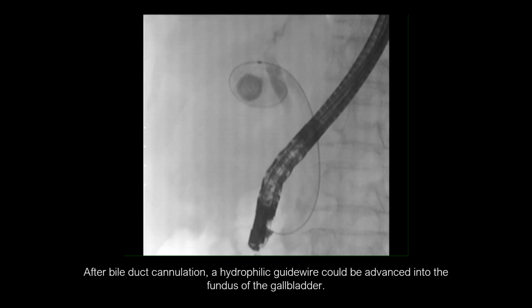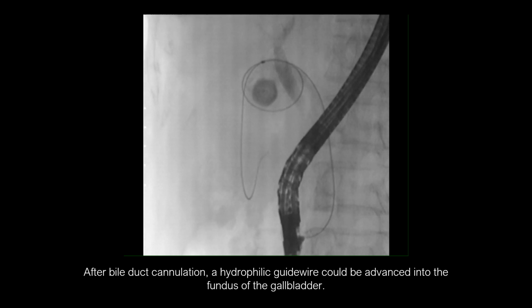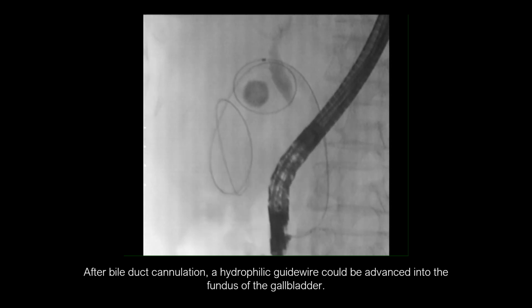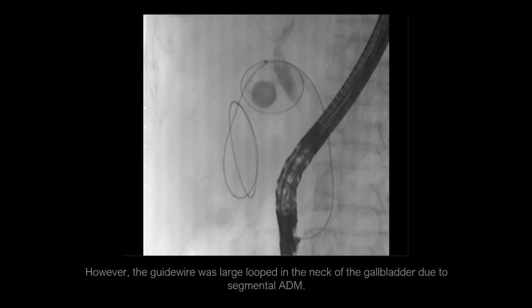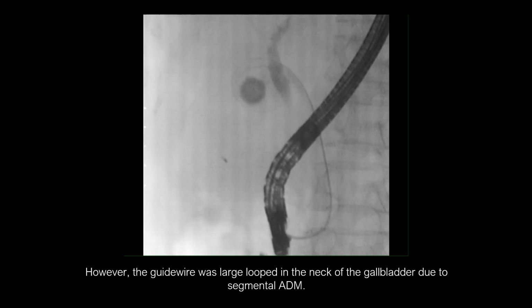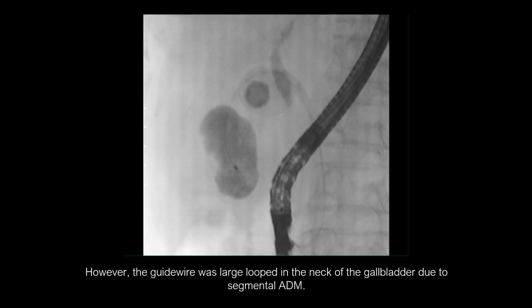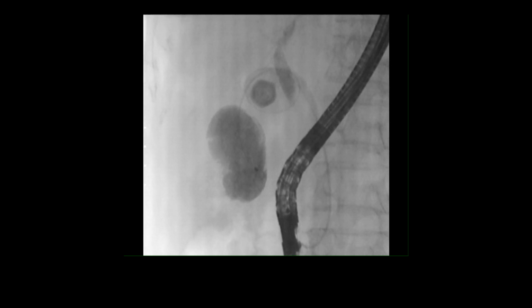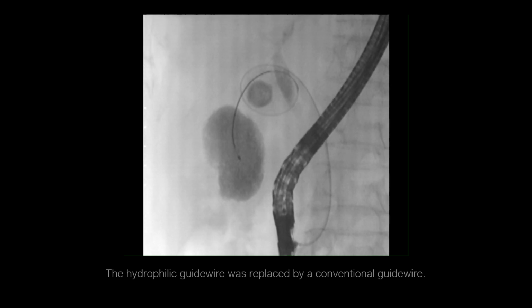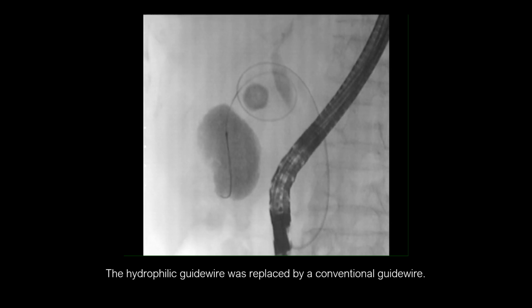After bile duct cannulation, a hydrophilic guide wire could be advanced into the fundus of the gallbladder. However, the guide wire was largely looped in the neck of the gallbladder due to segmental adenomyomatosis. The hydrophilic guide wire was replaced by a conventional guide wire.